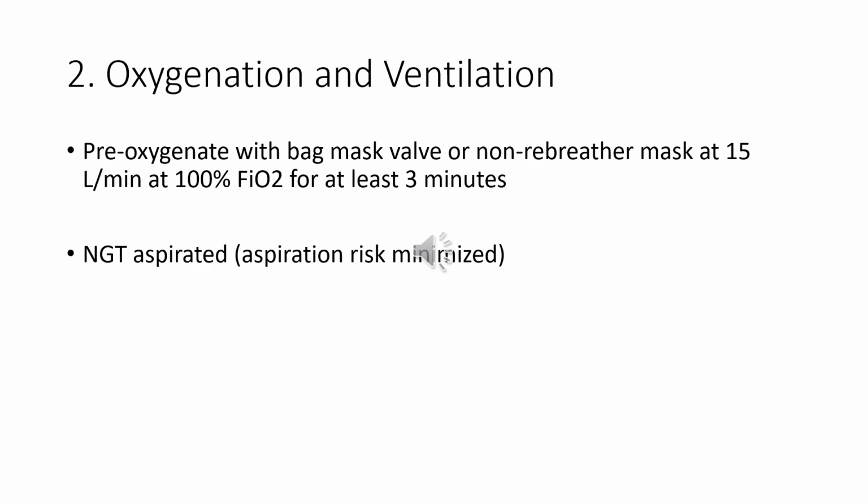Preoxygenation increases oxygen reserves, prolonging the safe apnea period and reducing the risk of hypoxemia. We can pre-oxygenate with either a bag valve mask or a non-rebreather mask at least 15 liters per minute at 100% FiO2 for at least 3 minutes.